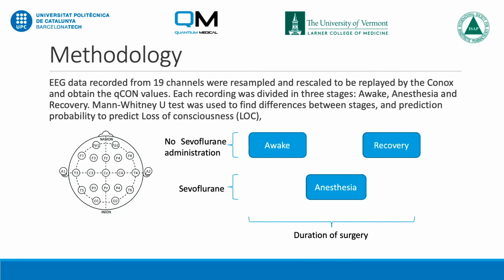We were recording EEG from 19 channels and resampled it in order to fit the algorithm of the qCON monitor and obtain the qCON values. Each recording was divided into 3 stages: awake, anesthesia, and recovery. The data were recorded at the University of Vermont Medical Center, and thank you to our collaborators at the University of Vermont who provided us with the data.